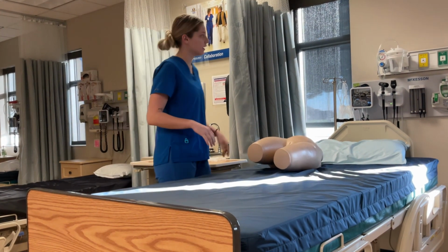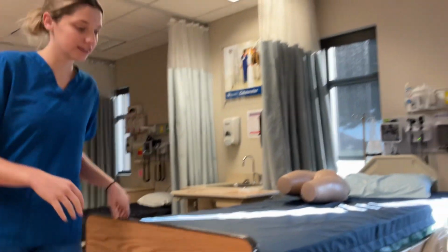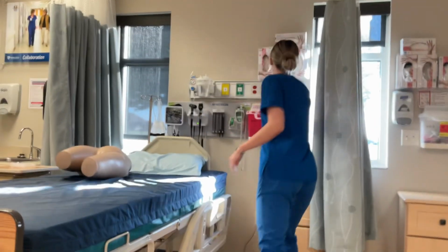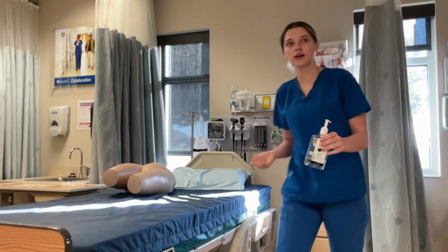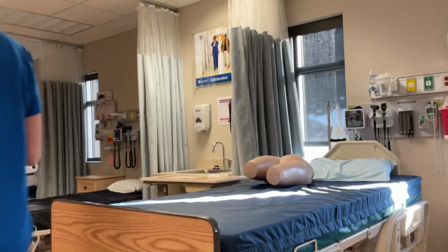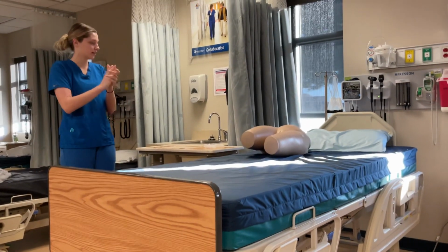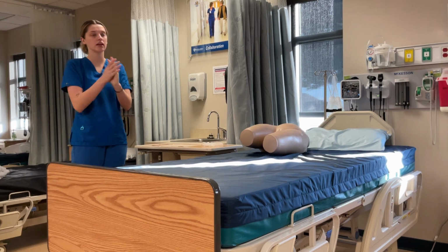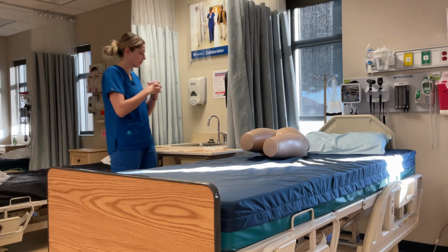Provide hand hygiene. Come over here. And I would provide privacy. Just going to grab this. For PPE today, I need normal gloves.